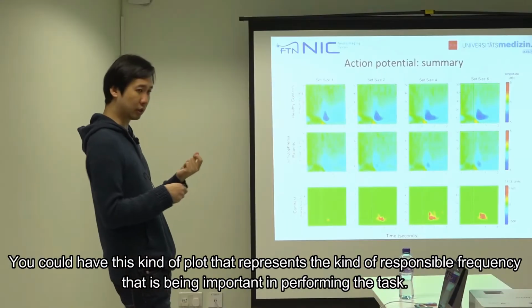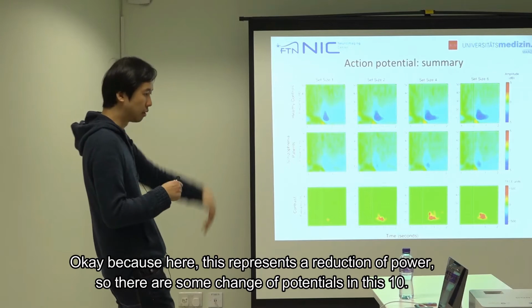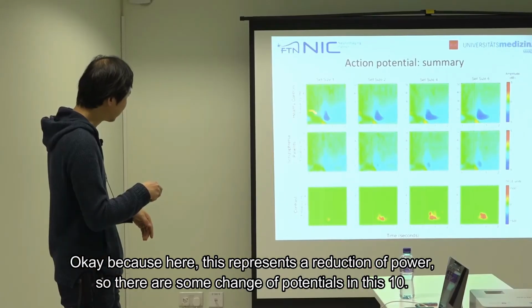This plot represents the responsible frequency that is important in performing the task. Okay, because here it represents a reduction of power, so there's some change of potentials in this 10 Hertz range.